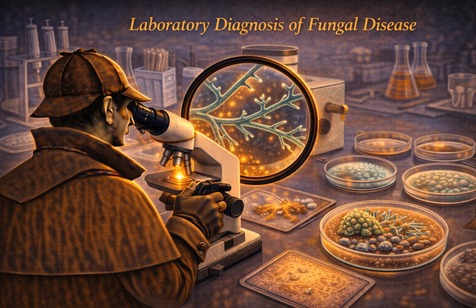Now, KOH is great, but it requires a really trained eye to spot those transparent hyaline hyphae against a clear background. It's like looking for glass in water. There is a way to make them pop out, though. Calcofluor white. I think of this as the highlighter. That is exactly what it is.